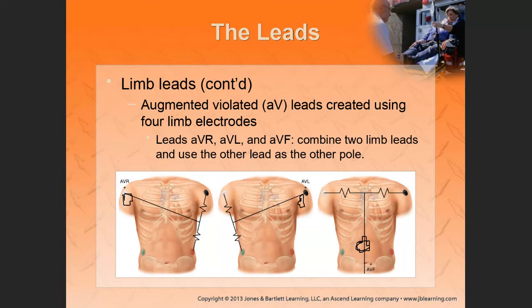Left, right? So lead 1 looks at the left side. Which side of the heart do lead 2 and lead 3 look at? Right, inferior. Good. Inferior. All right. Which side of the heart?